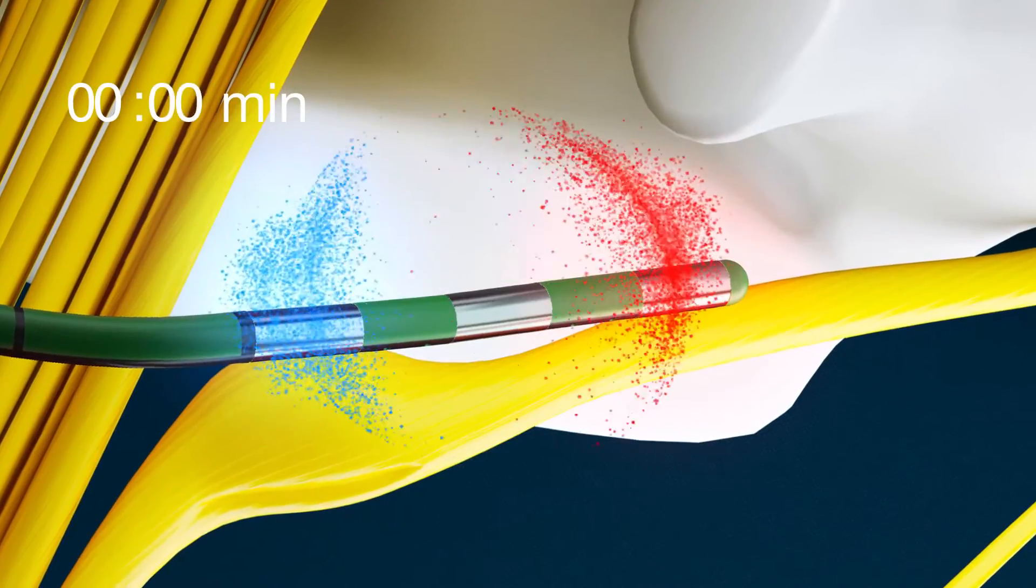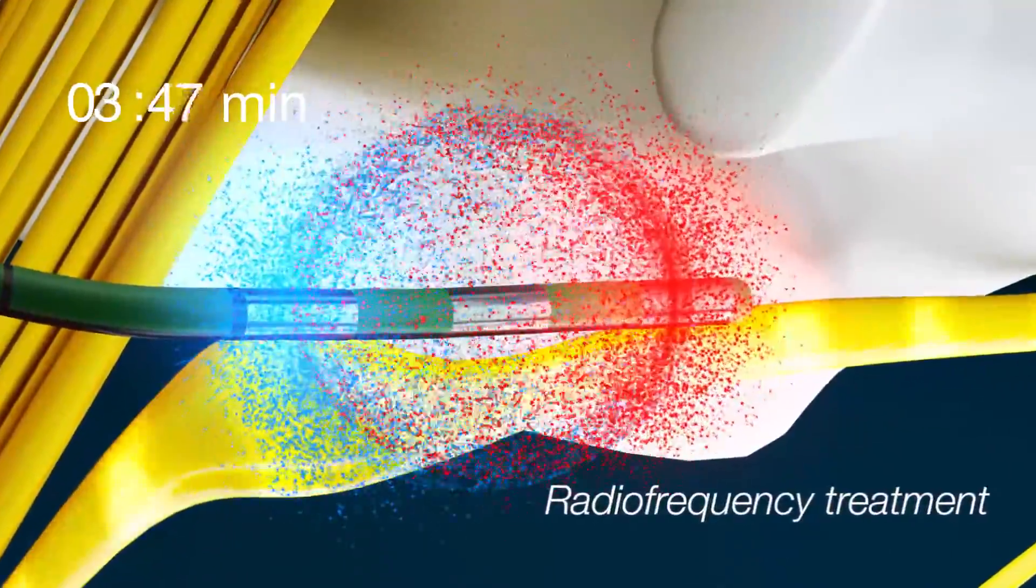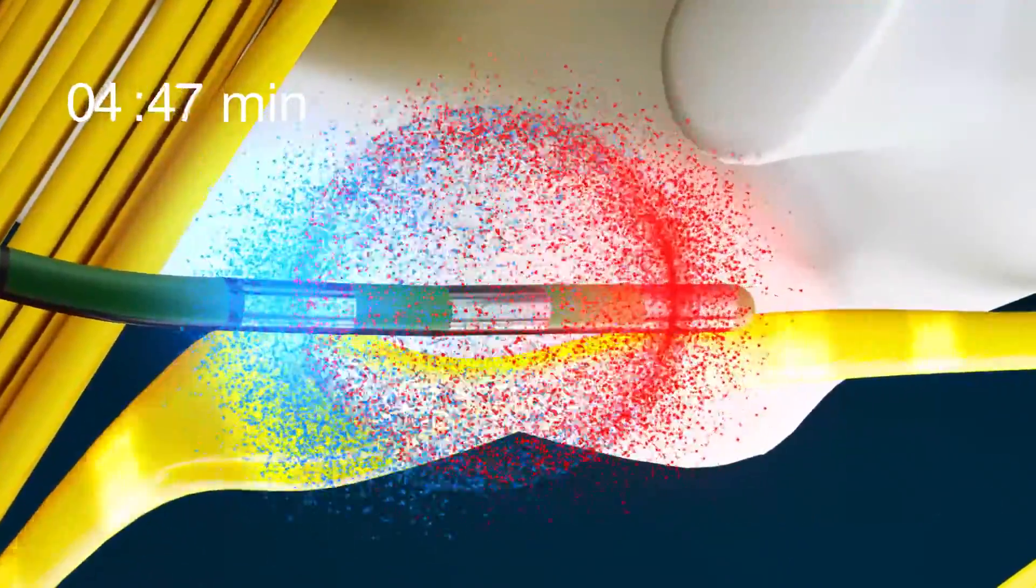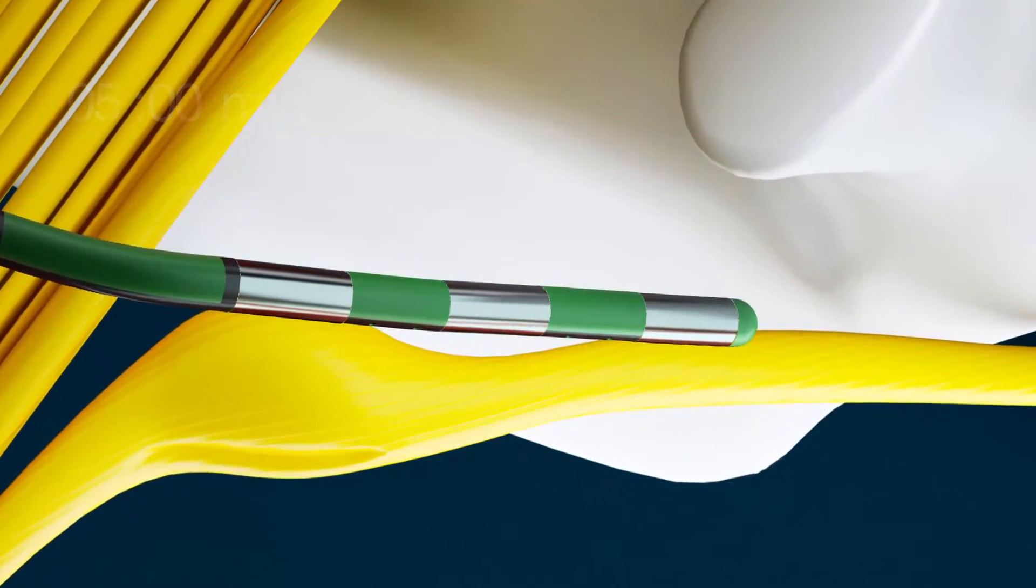The treatment lasts 5 minutes at a temperature not exceeding 42 degrees Celsius. After the first application, the treatment can be repeated on other nerve areas considered important for the success of the intervention.